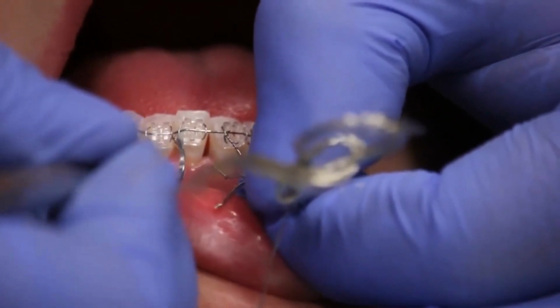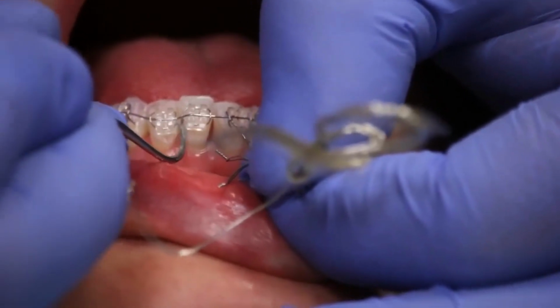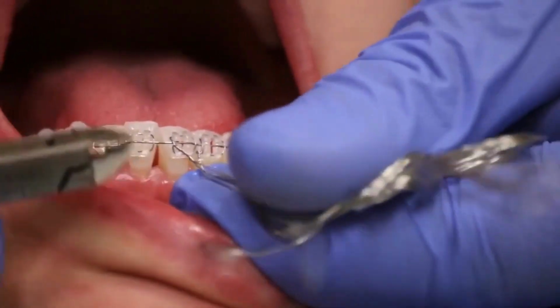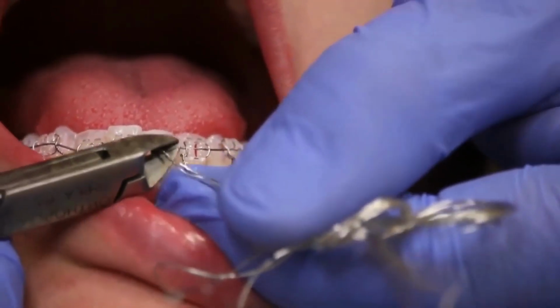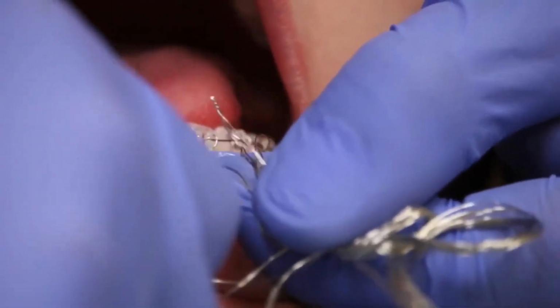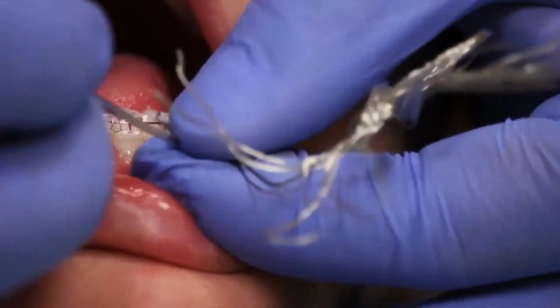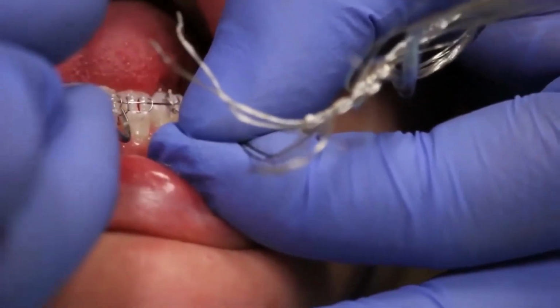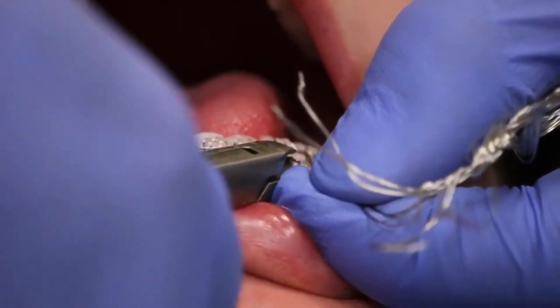We don't want the tie poking the patient's papilla, and we don't want it to stick out or the patient will not be able to floss. You saw me using the end of a sickle to push those two ties because the contact is very tight in there, and my plier may just torque the bracket and break the cement because it's too thick. So like on this case, I would use a thinner instrument like my sickle. You can also use a ligature director and push the wire towards the contact.